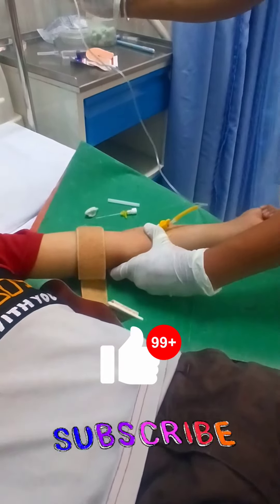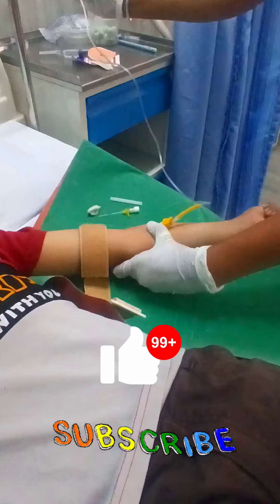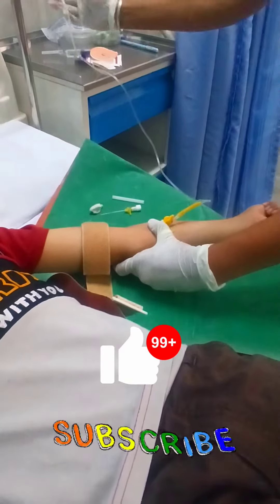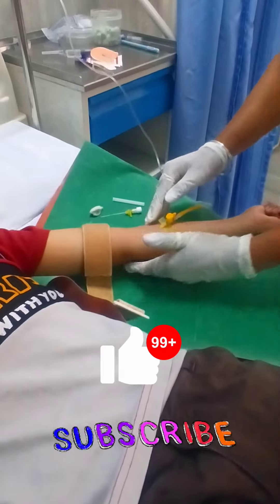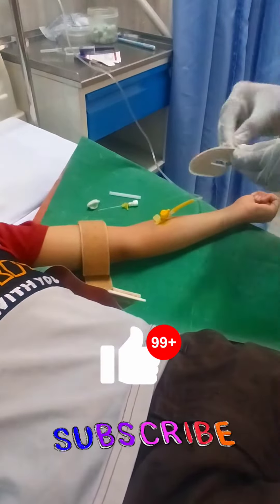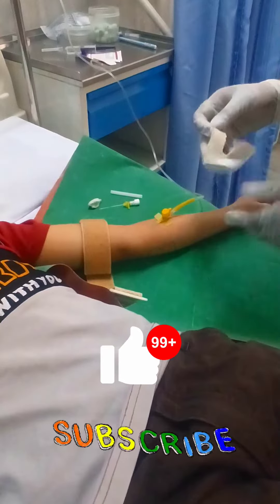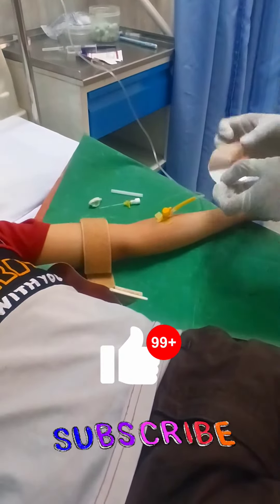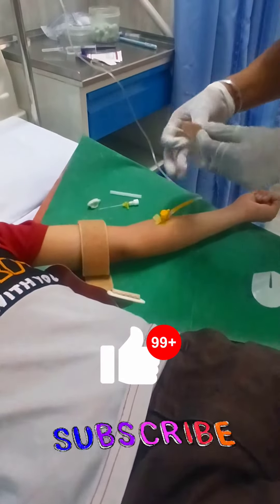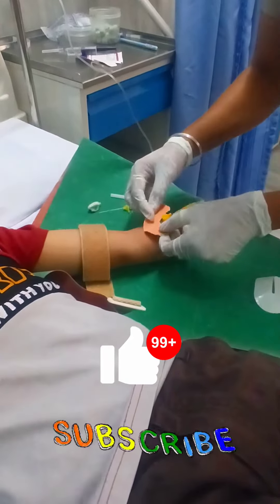While starting the procedure, firstly we have to introduce ourselves to the patient and tell them: 'I am going to insert a cannula — don't fear and be comfortable.' The second thing is to sanitize our hands and wear gloves. The third thing is vein selection. I have already told you how to select the vein.